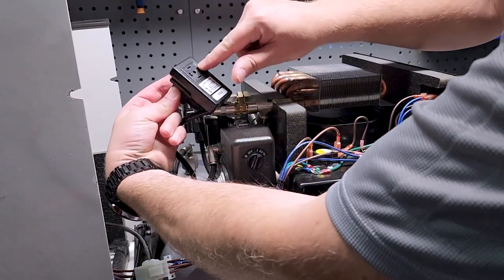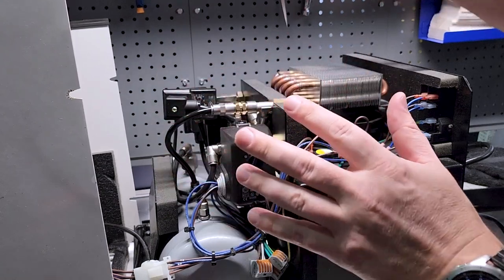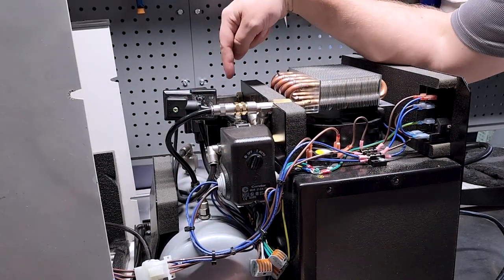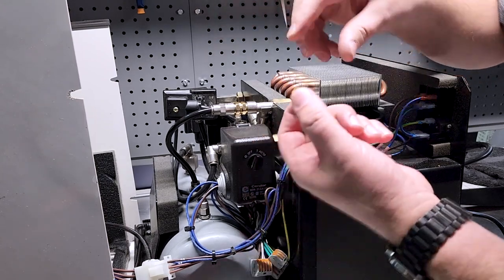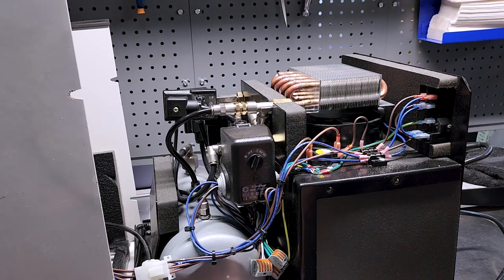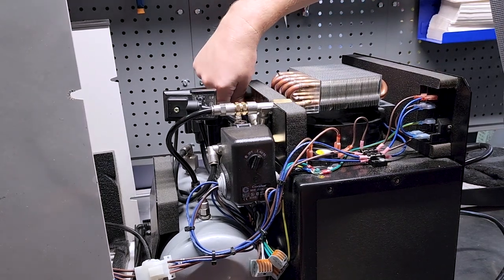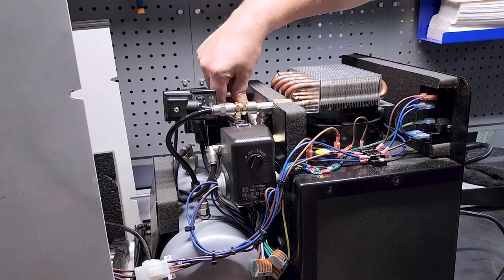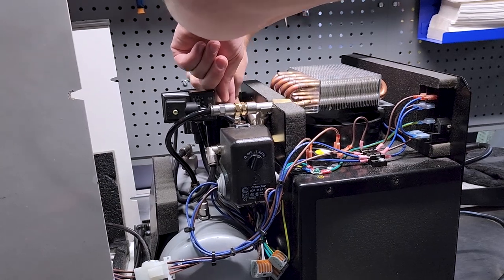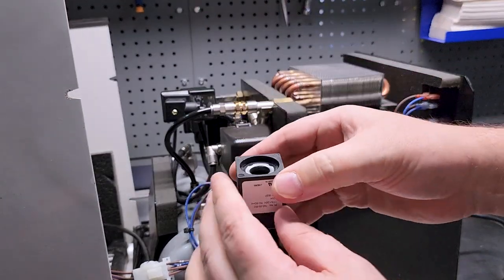So this guy here is just a plug. It's just an interface with the timing mechanism. Doesn't really do very much. The physical piece is actually done by the solenoid coil, which is down here. In order to remove that, we have a cap, which is a retainer. I pull that cap off, and then the solenoid valve body, or the coil itself, just kind of slides off. So what you are hearing, and let's see if we can get a light in there so you can see it.